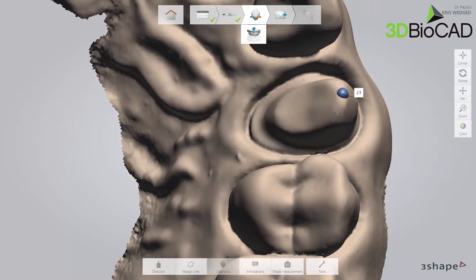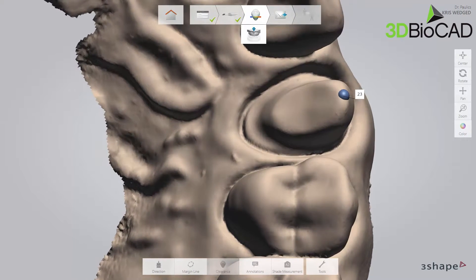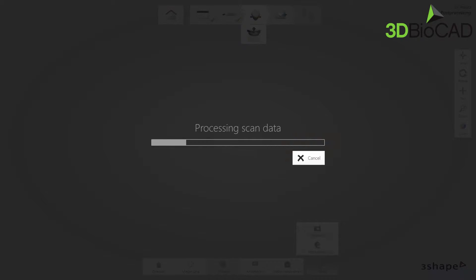Let's illustrate what to do and the difference it makes. Now post-process the scan — click the post-process button in the Tools menu. Please note that when doing post-processing using the Tools menu in the Analyze step, it will take some time and you will have to wait for the process to finish before continuing your work on the case. The better the PC performance, the shorter the post-processing time. Also, smaller scans will require less post-processing time than large cases.